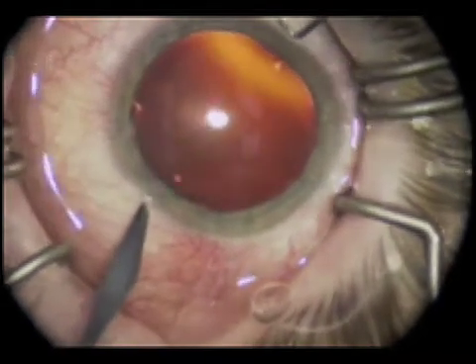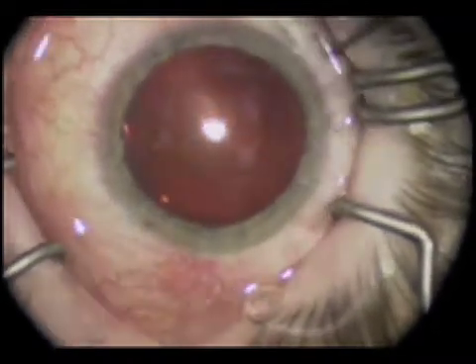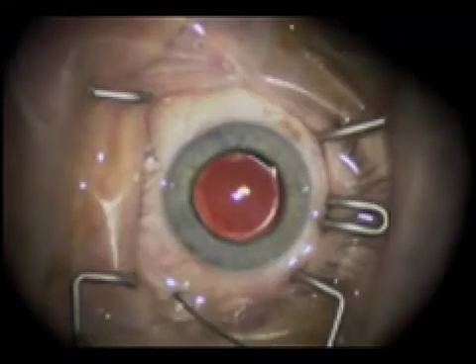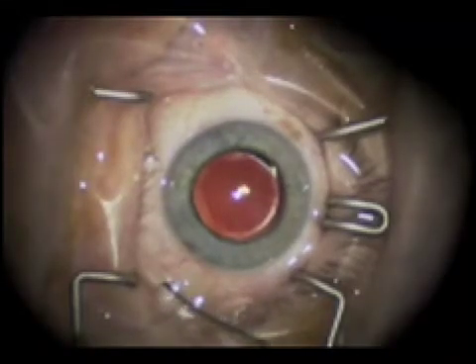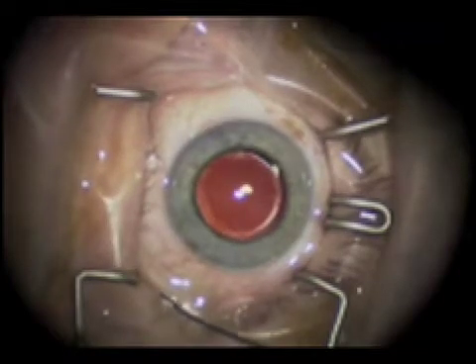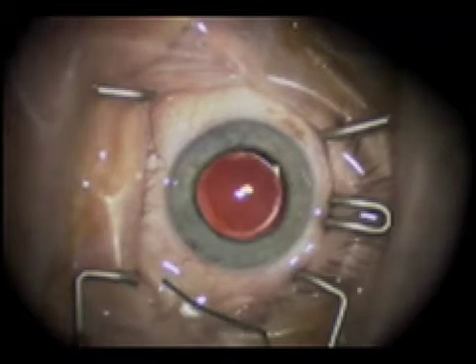This is the left eye. It is clear that the superior limbus is very well exposed. This is an early prototype of the speculum where the superior blade had three posts and the inferior blade only had two. It demonstrates another important advantage of the triple post design.